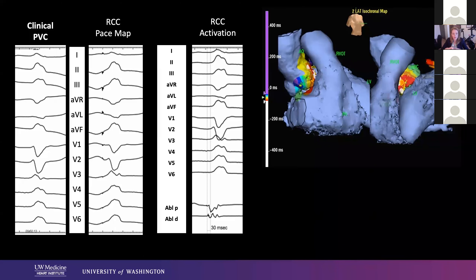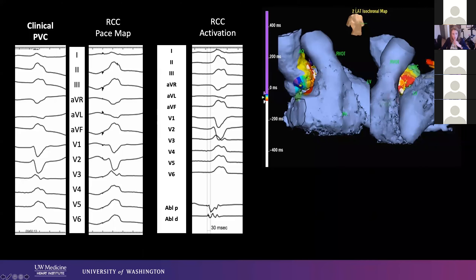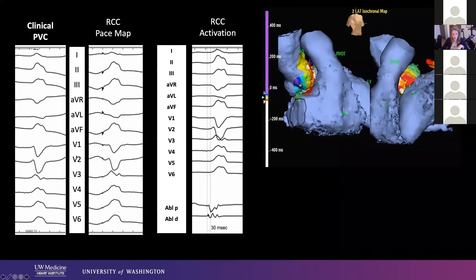From a practical standpoint, it's pretty stripped down for me. I'm going to use an ultrasound catheter and an ablation catheter. For a case like this, I'll get arterial access up front. Because we were so positive in lead one and had that early transition, we were thinking we'd end up in the cusp — and sure enough, we were.